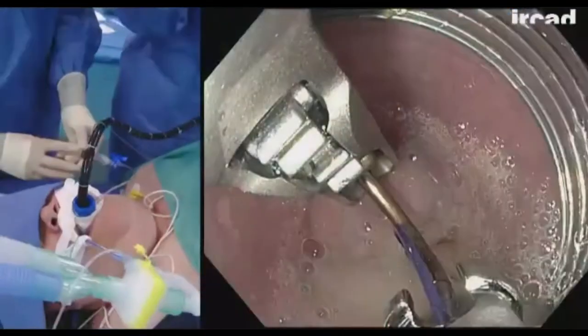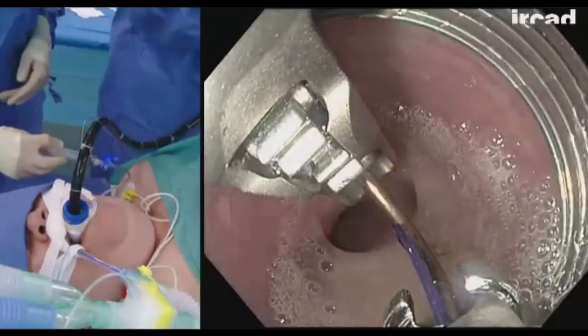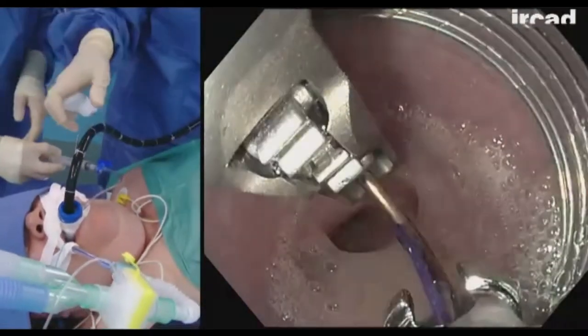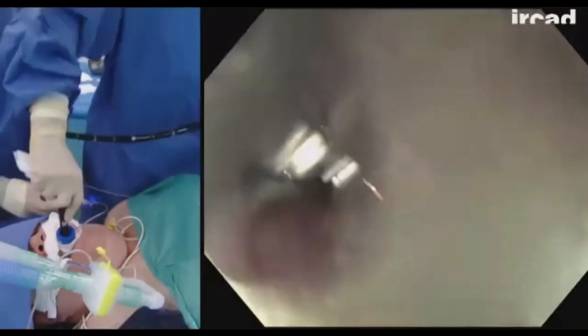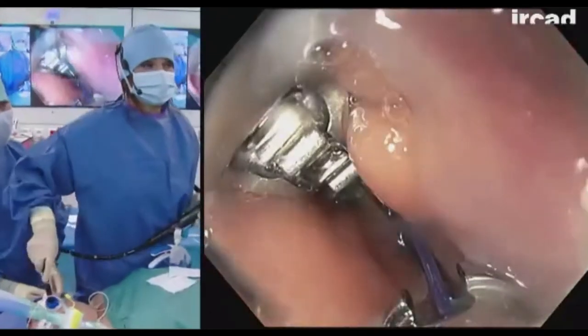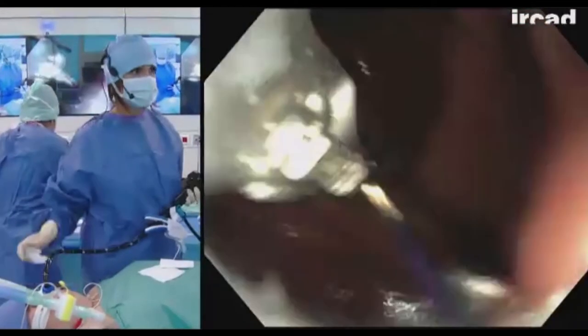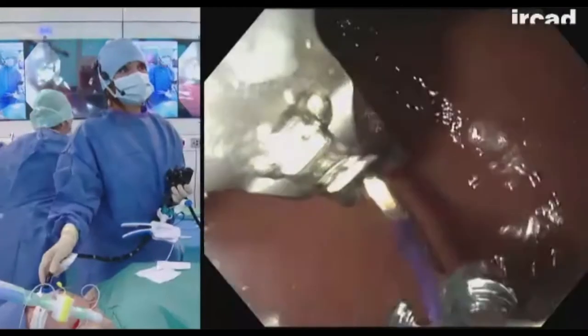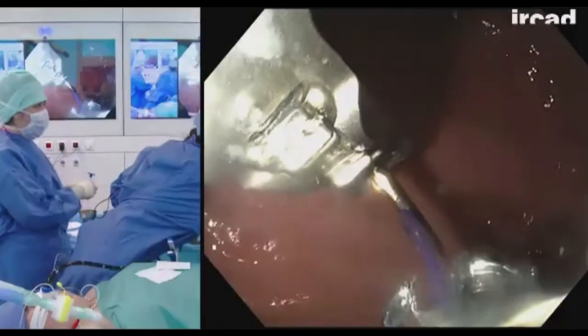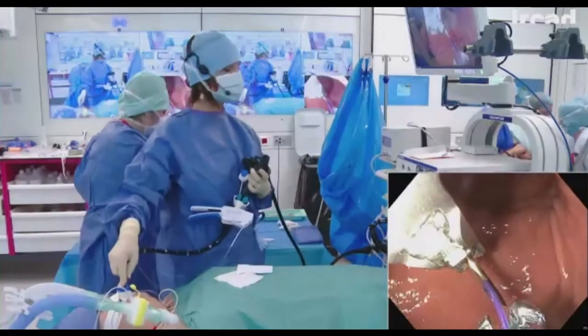So if I push now, I'm pushing blindly. So I don't know where I'm going, and I do have a risk of perforation. When she's inflating the balloon, I have a beautiful view, and I can go ahead and introduce everything in a very safe and secure fashion. There we go. So we are inside the stomach, and I'm going to show you our landmark. Increase the light and decrease the light in the room if possible. Please lower the lights in the room.